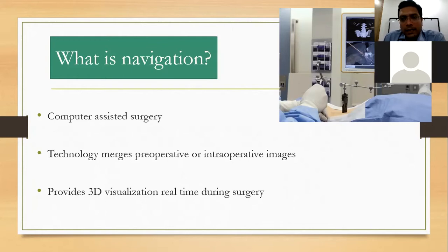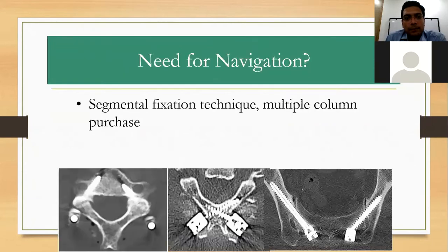So it is practically giving you a third eye, which helps you see what is not seen on the intraoperative table when the patient is on your table, and helps you guide implant positions or implant placement accurately.